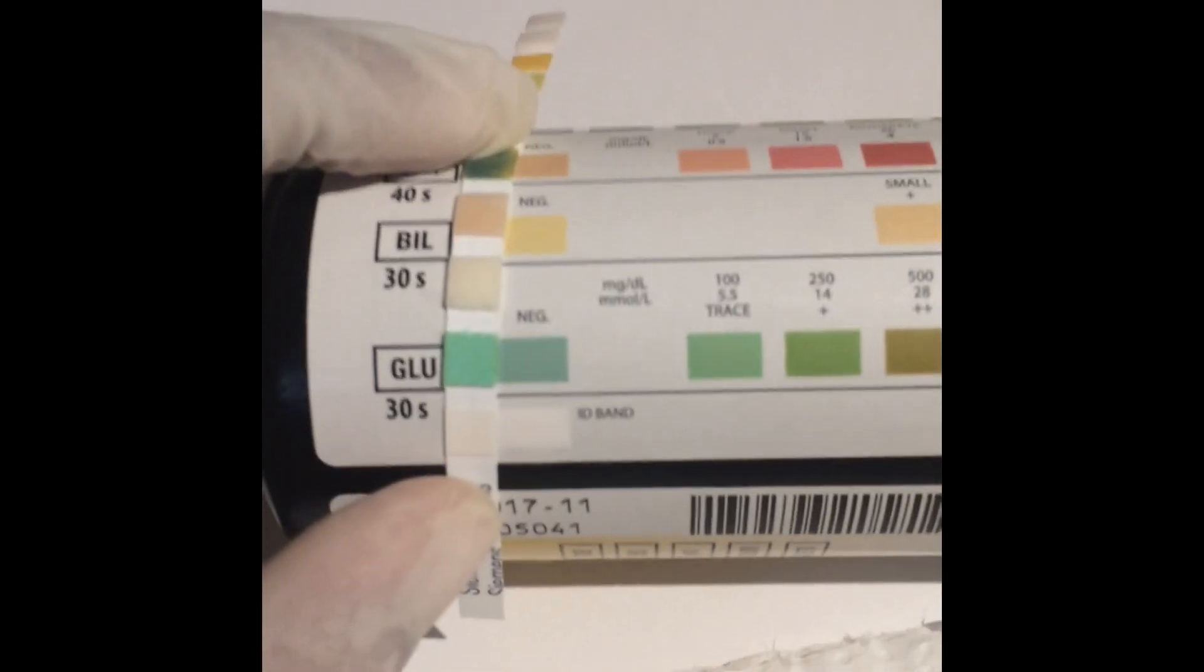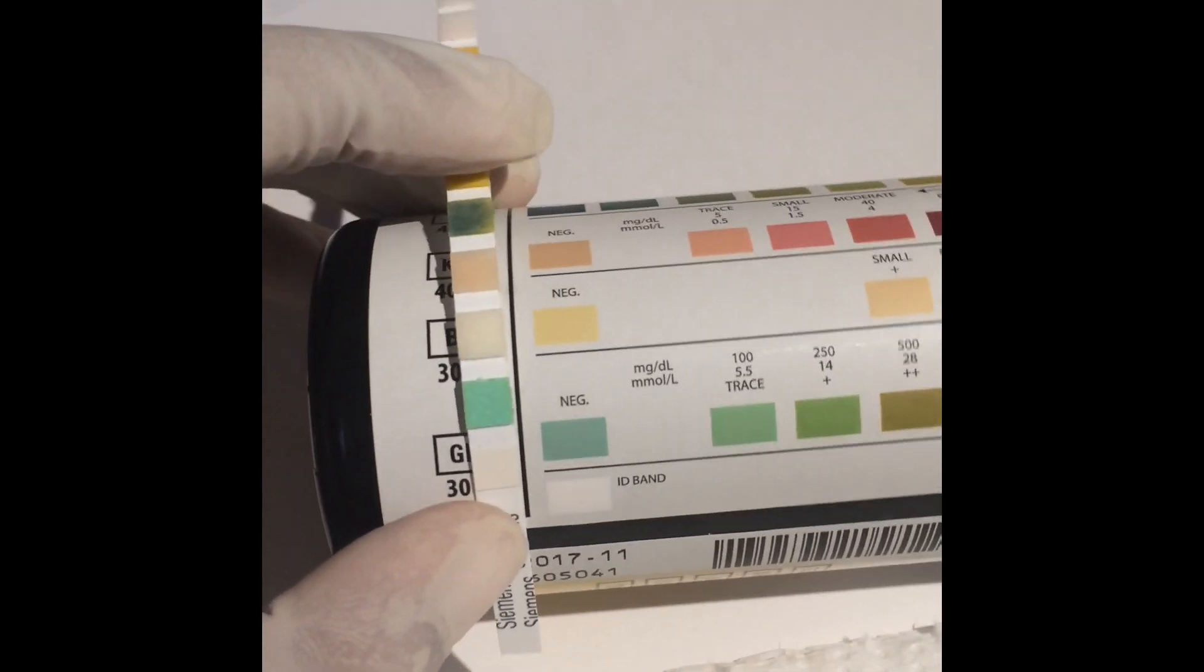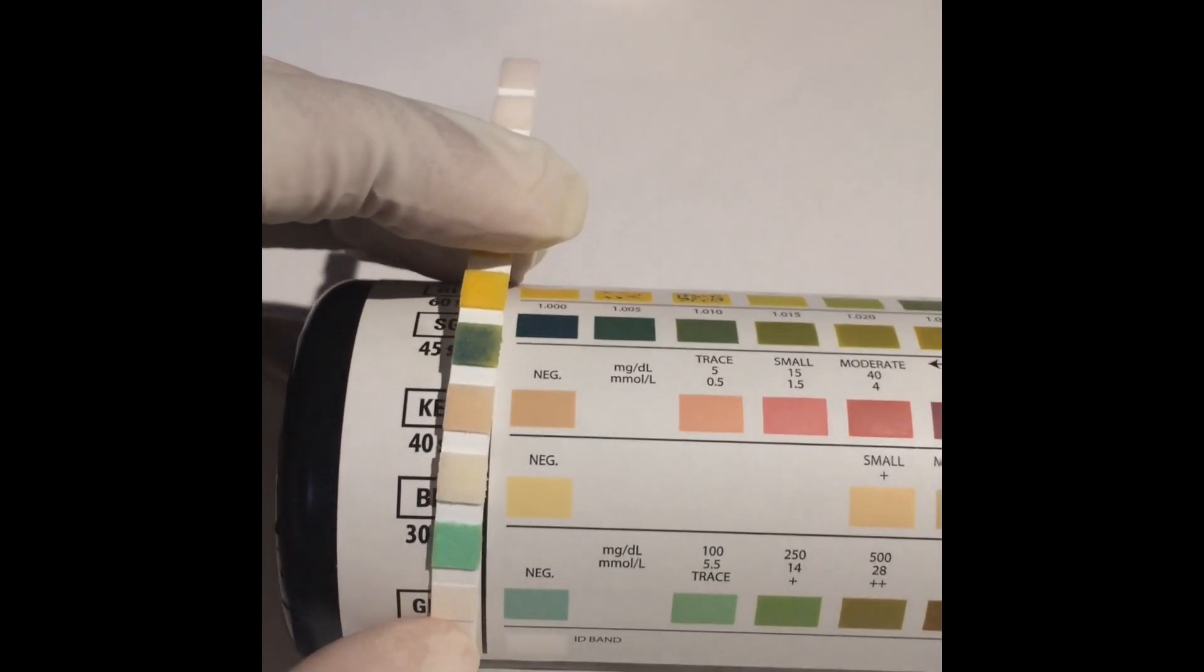First up, 30 seconds: glucose negative, bilirubin negative, ketones negative as well.